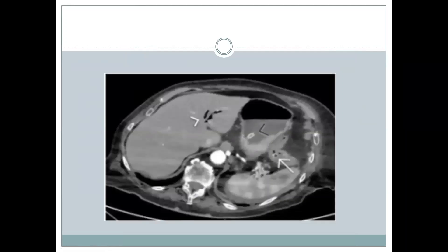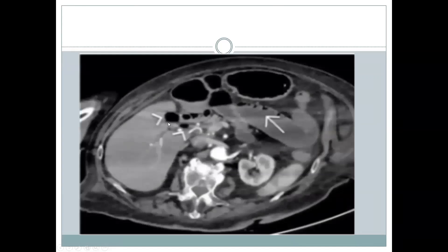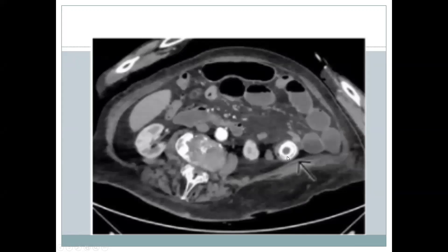A few more images. This is how pneumobilia looks on CT. And again, here is pneumobilia, dilated small bowel loops, and a gallstone in the distal small bowel loops.